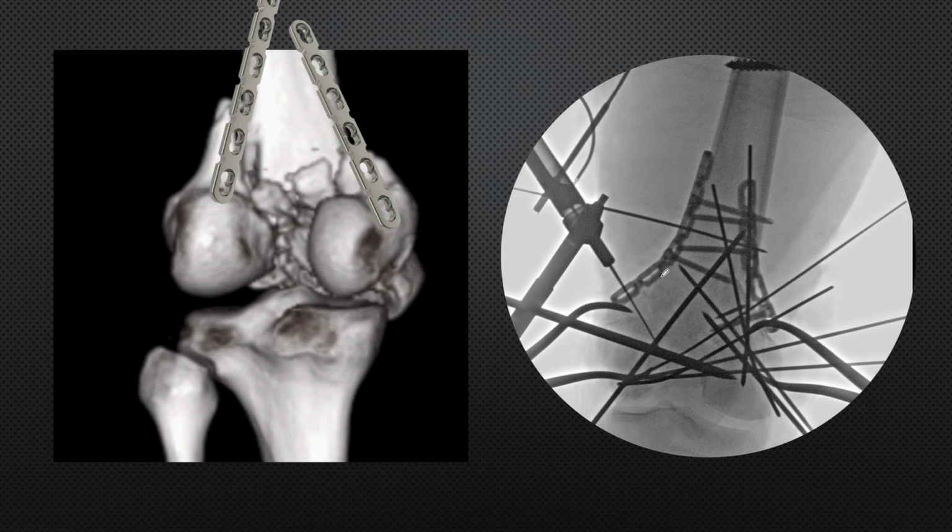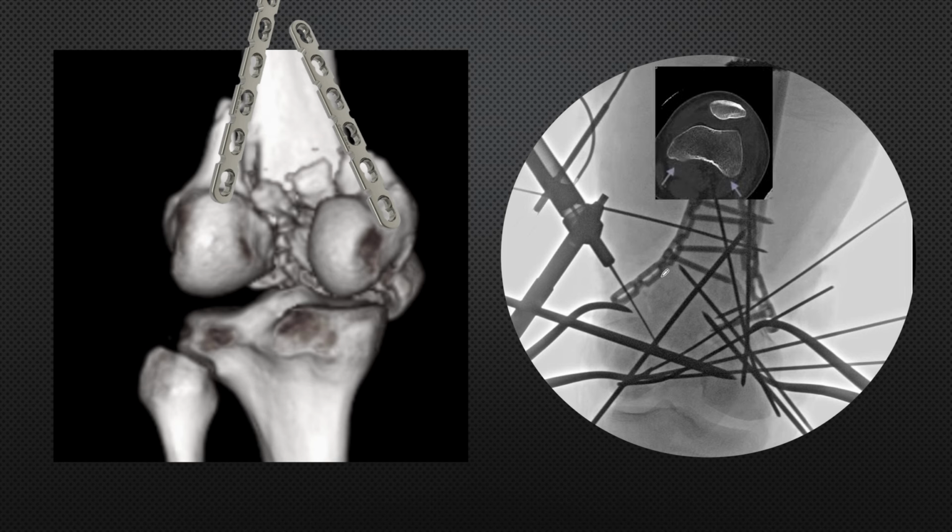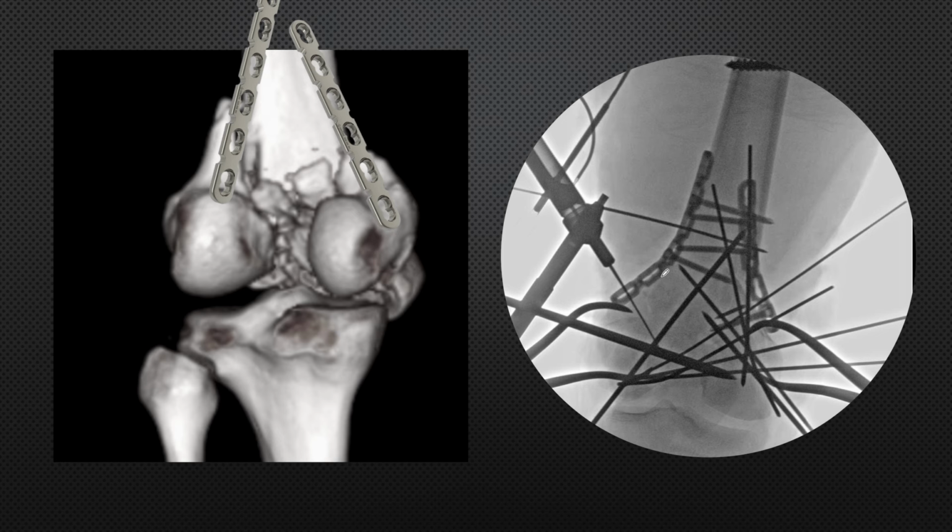By just reduction of these ridges, you'll be able to do half of your work, because if you see the bone quality of these ridges, the bone is very thick here. They are actually kind of pillars that are supporting the femur. So we have to reduce and stabilize these ridges so that everything remains stable.